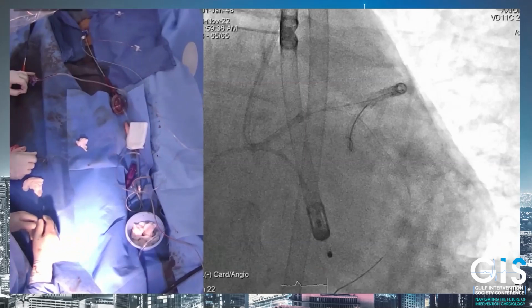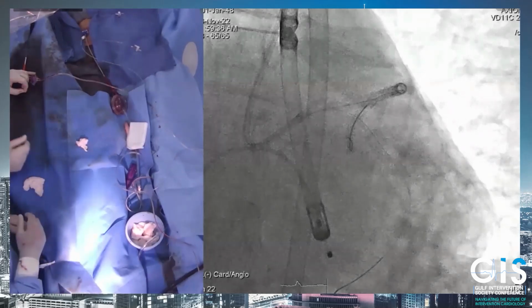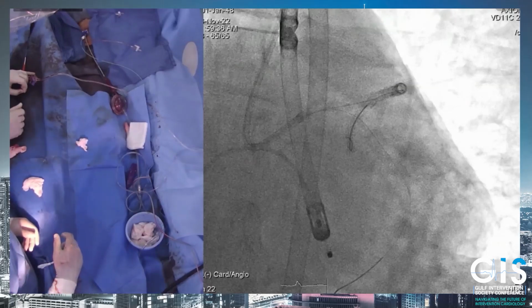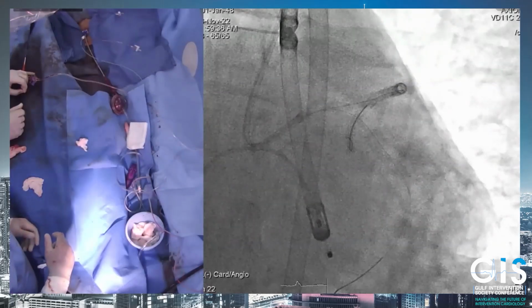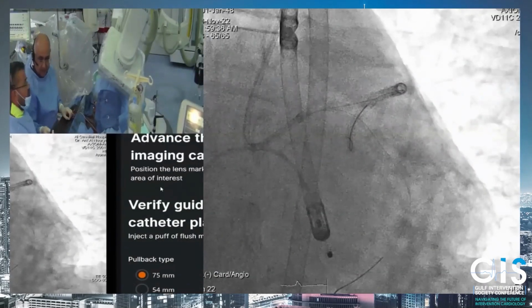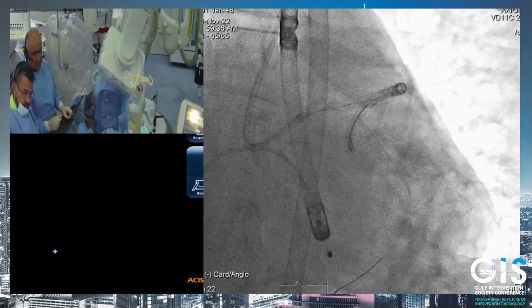So what do you think, Mohammed? How do you think? Do I go with the IVUS directly, try, because you know the catheter is a little bit more hard, more stiff, so it could cross? Or would you go with the 2 balloon? Would you use debulking from just the start now?